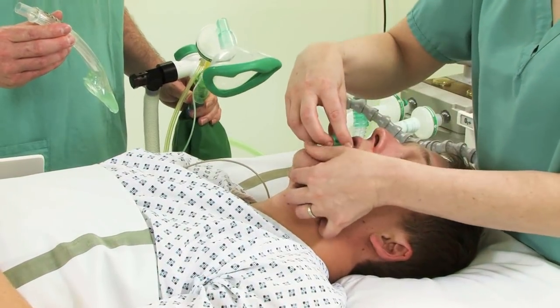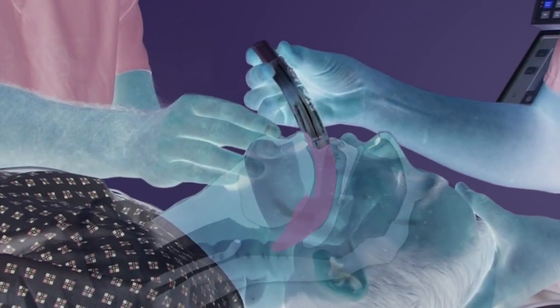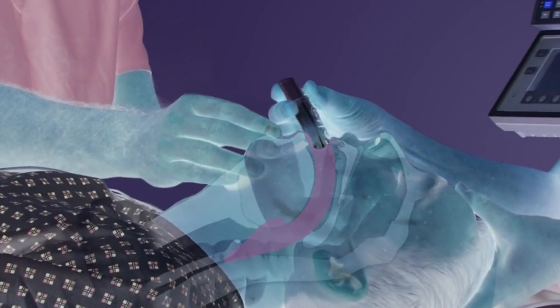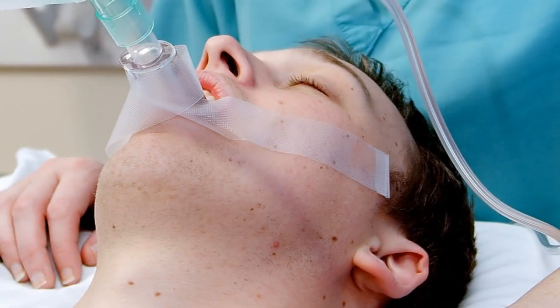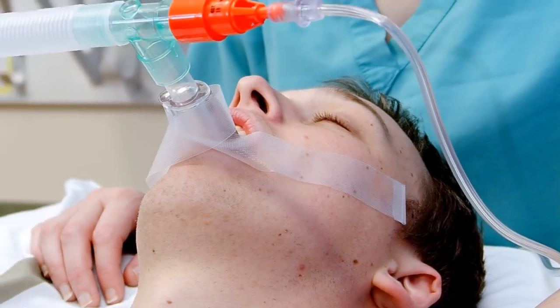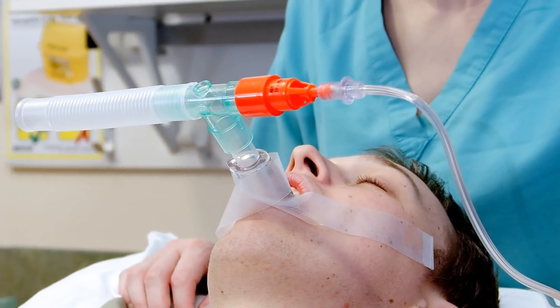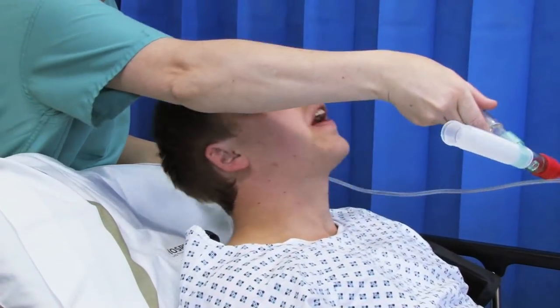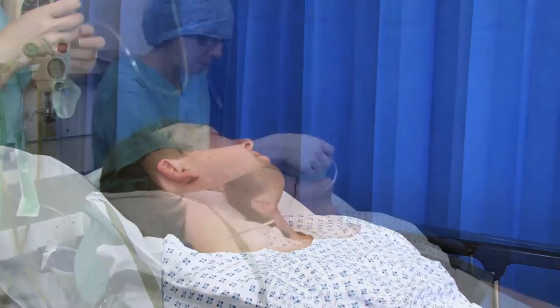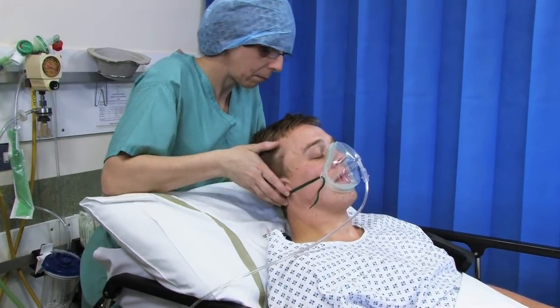The device should now be inserted according to the manufacturer's instructions for use and taped down maxilla to maxilla. Once the patient is taken into recovery, the patient's airway will need to be maintained and oxygen administered via a T-piece. The iGel or laryngeal mask will need to be removed and oxygen delivered via an MC mask.